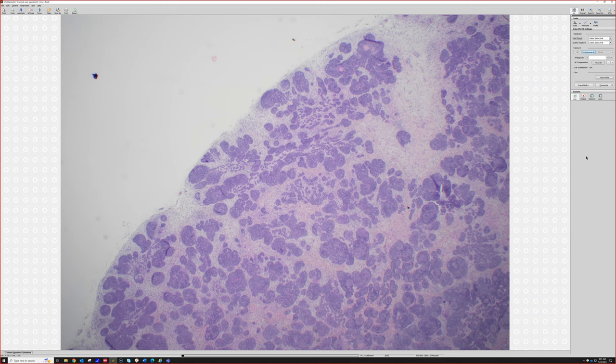Well, basal cells don't grow that way, right? Basal cells almost always either connect directly to the epidermis or an adnexal structure, and they usually start in the superficial dermis or epidermis and then grow down. You can have them grow down to the subcutis, but they're not going to present as a solitary circumscribed nodule deep down. The other thing that helps me is to look at the stroma.